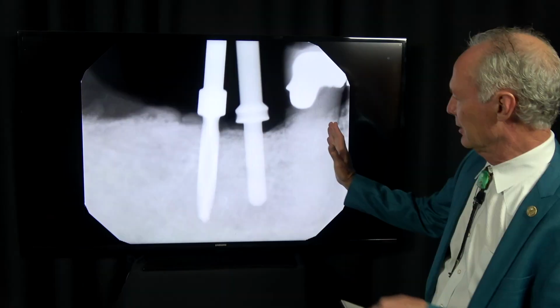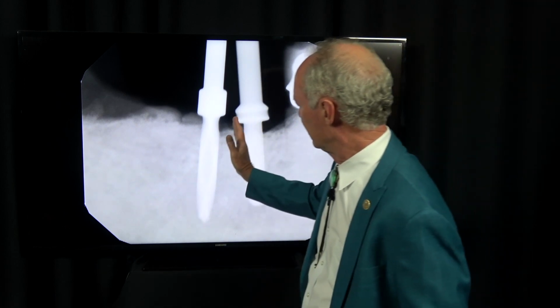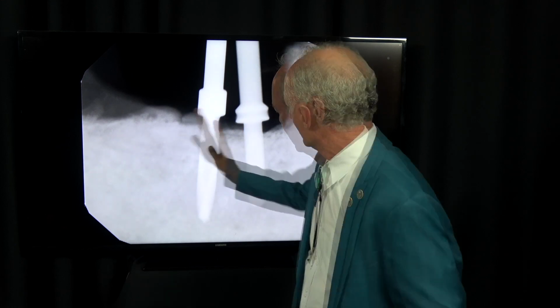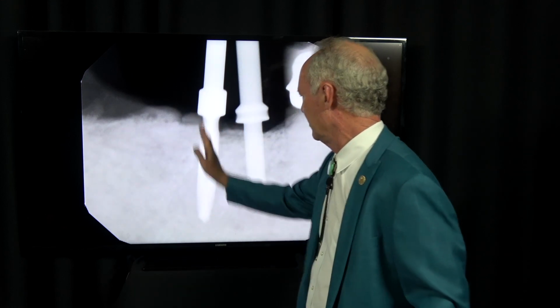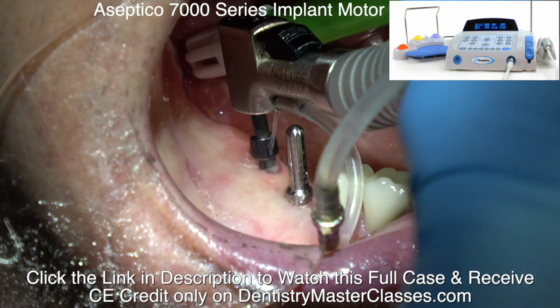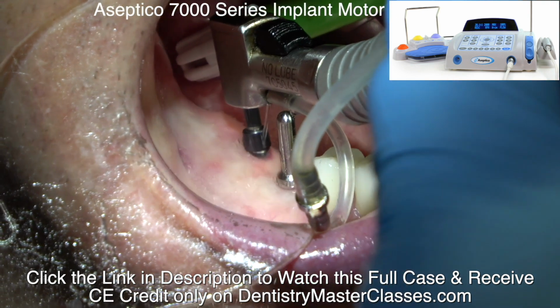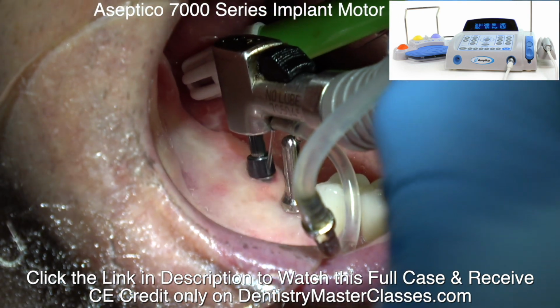See, these are a little bit this way, that would work fine, but as I drill this osteotomy, I'm going to move it back just a little bit and change the angulation, which is easy to do because each drill is progressively wider. See, I'm pushing distally on that drill just to parallel it.